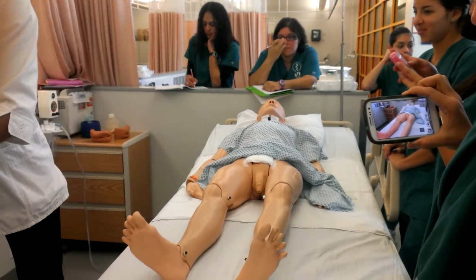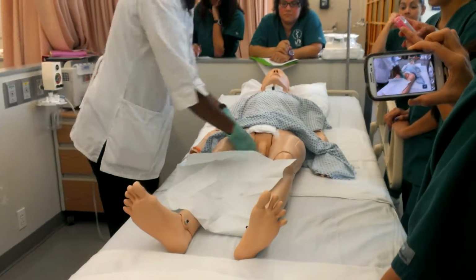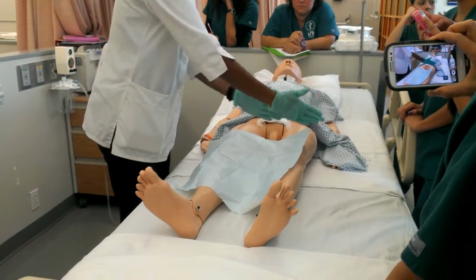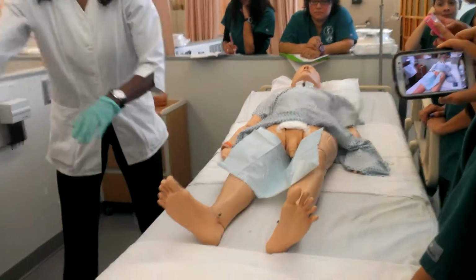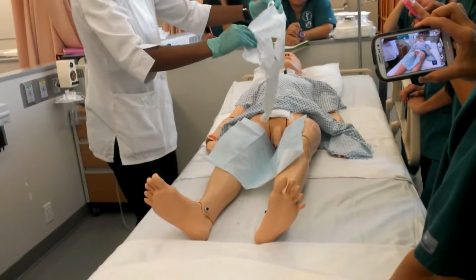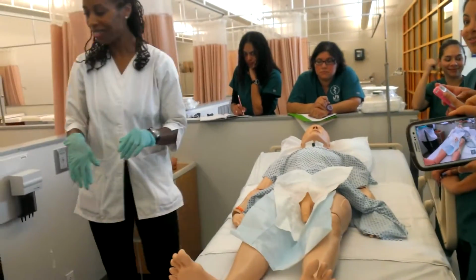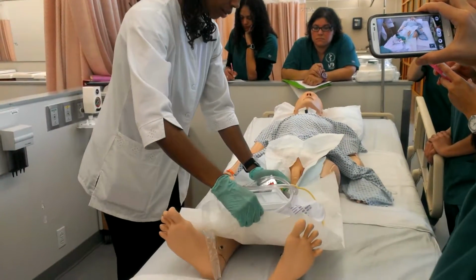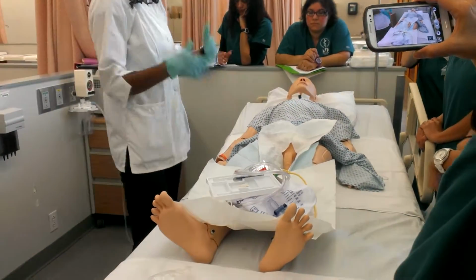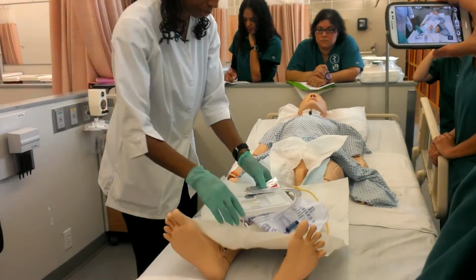And on the natural male, the anatomy will be higher. It wouldn't be so low in between the legs. So your setup will be right across the thighs. But this would just go under here, and you could still use this to target where you're going if you don't know where you're going. Hopefully you know where you're going. And then this would just basically be over the thighs. Even if they're awake, you just do it right over their thighs. That's how we do our setup.